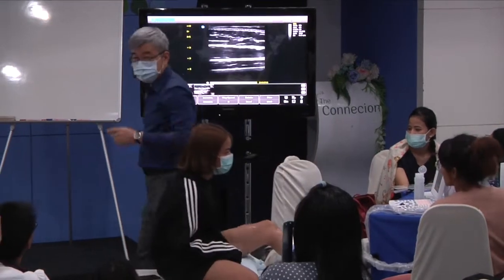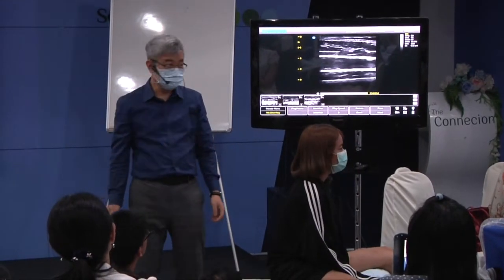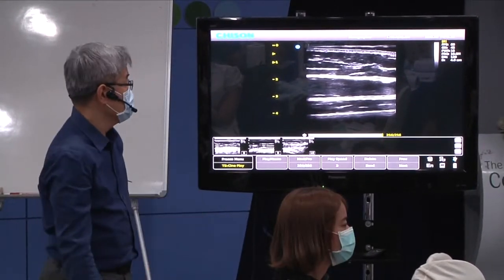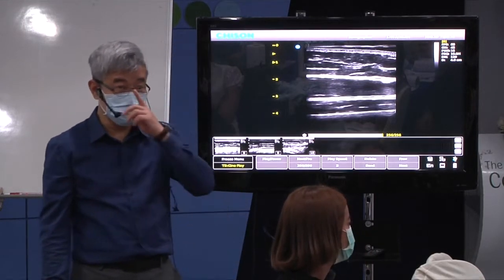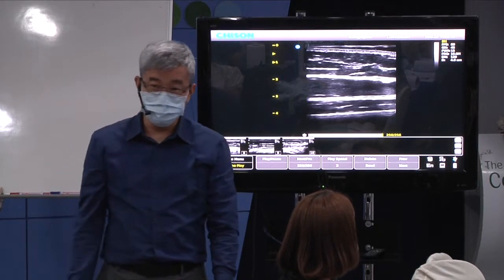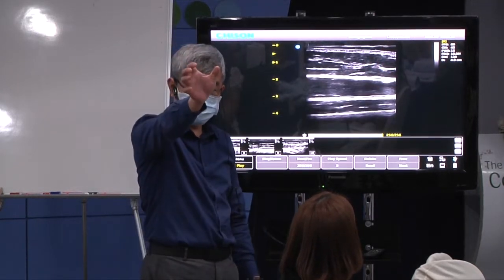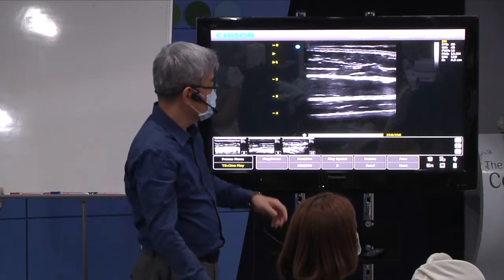If you get a job from community care and you are hired to measure the muscle thickness in very weak people, who cannot get up from the bed, you have to measure the muscle morphology when they are supine on the bed, and you send an image to me. I will check gel between probe and skin. It means no compression, no underestimation.